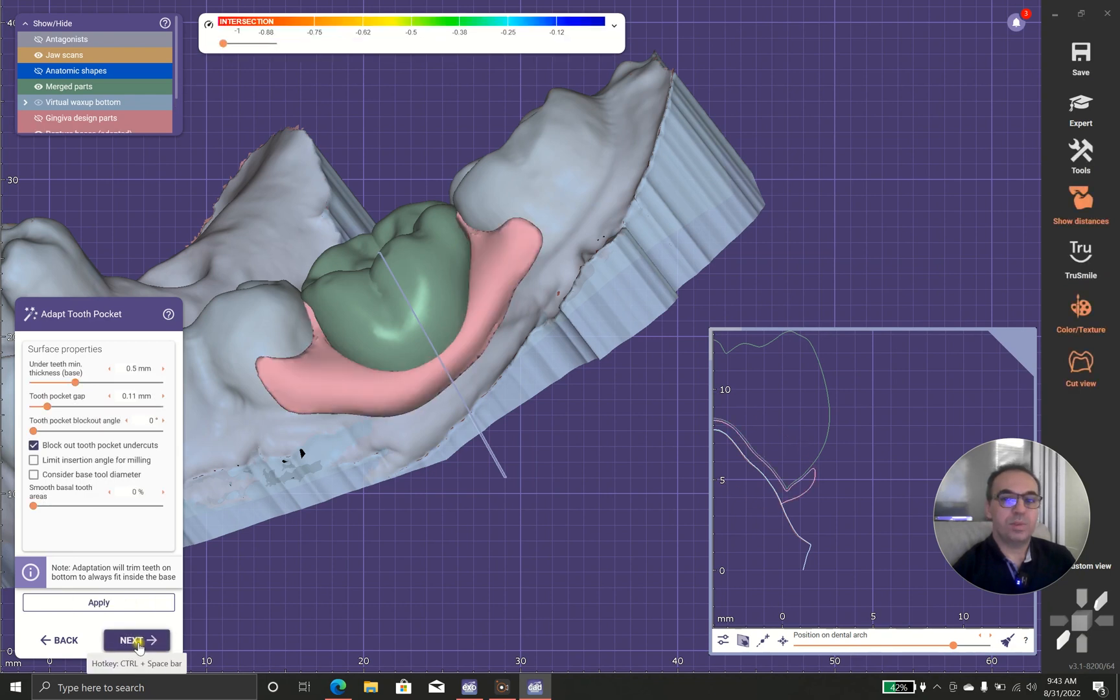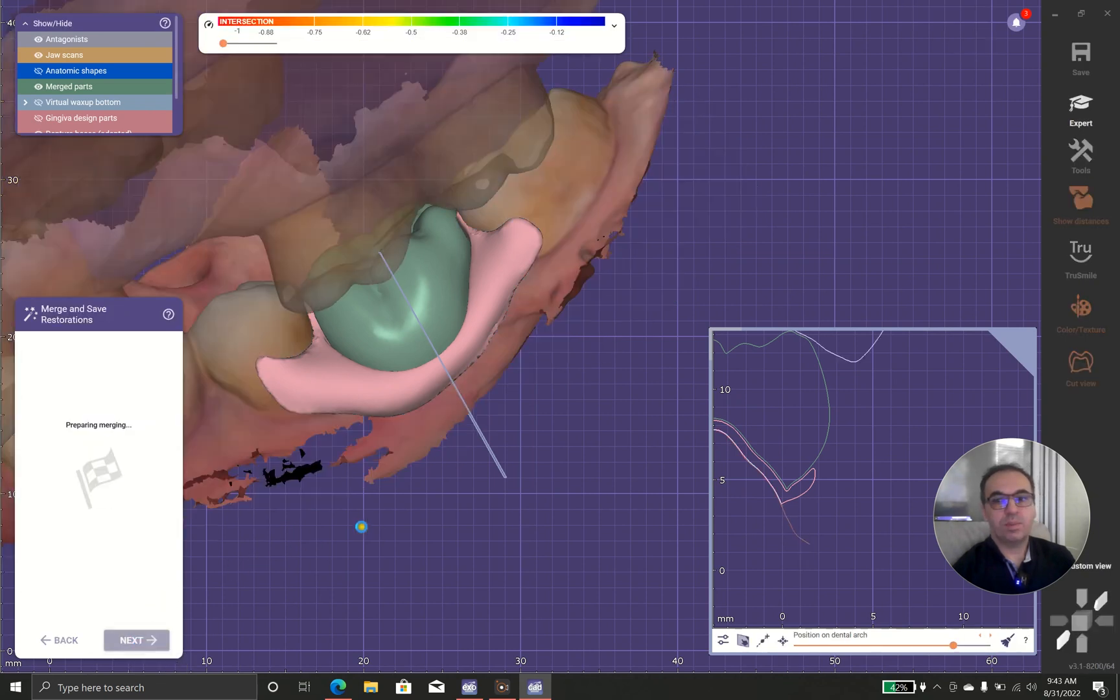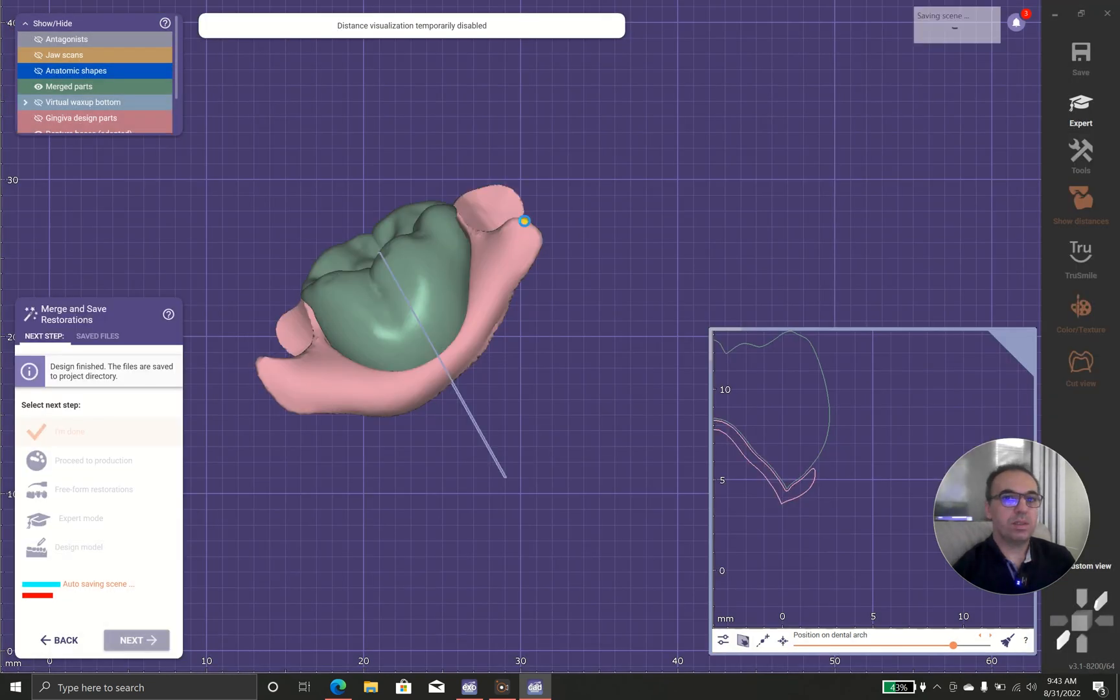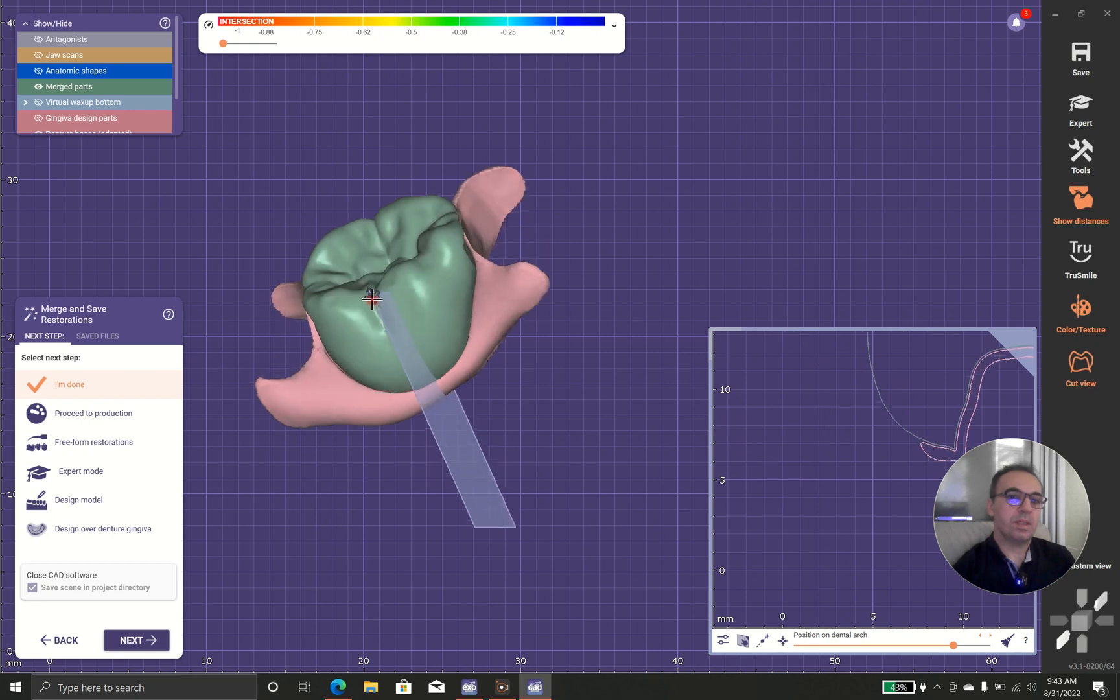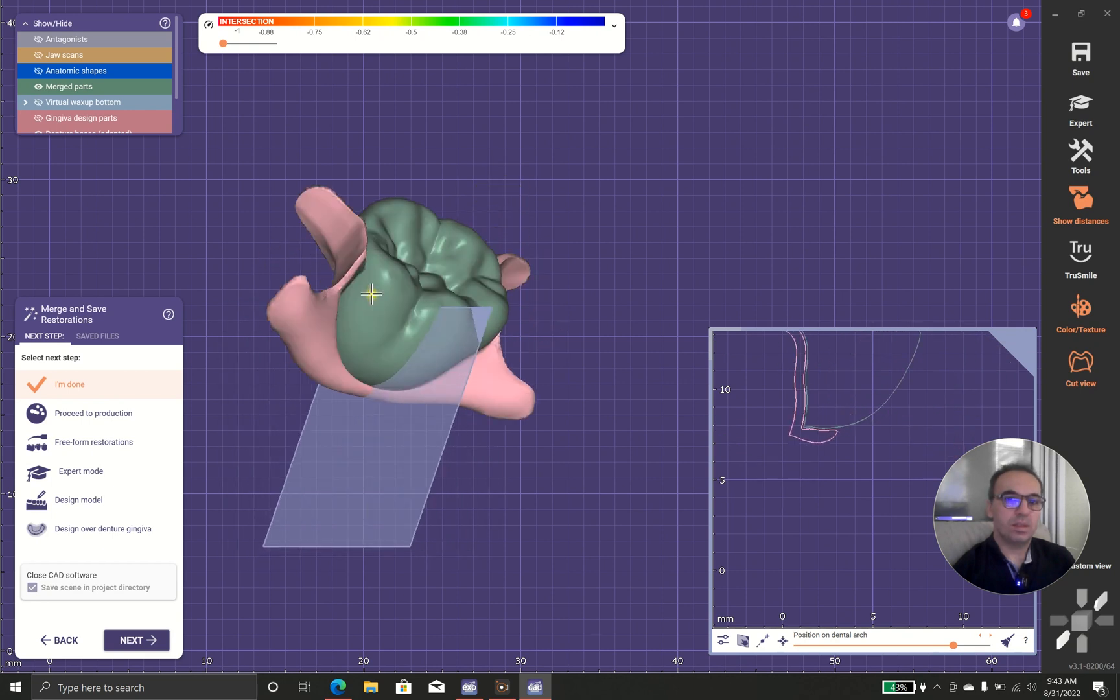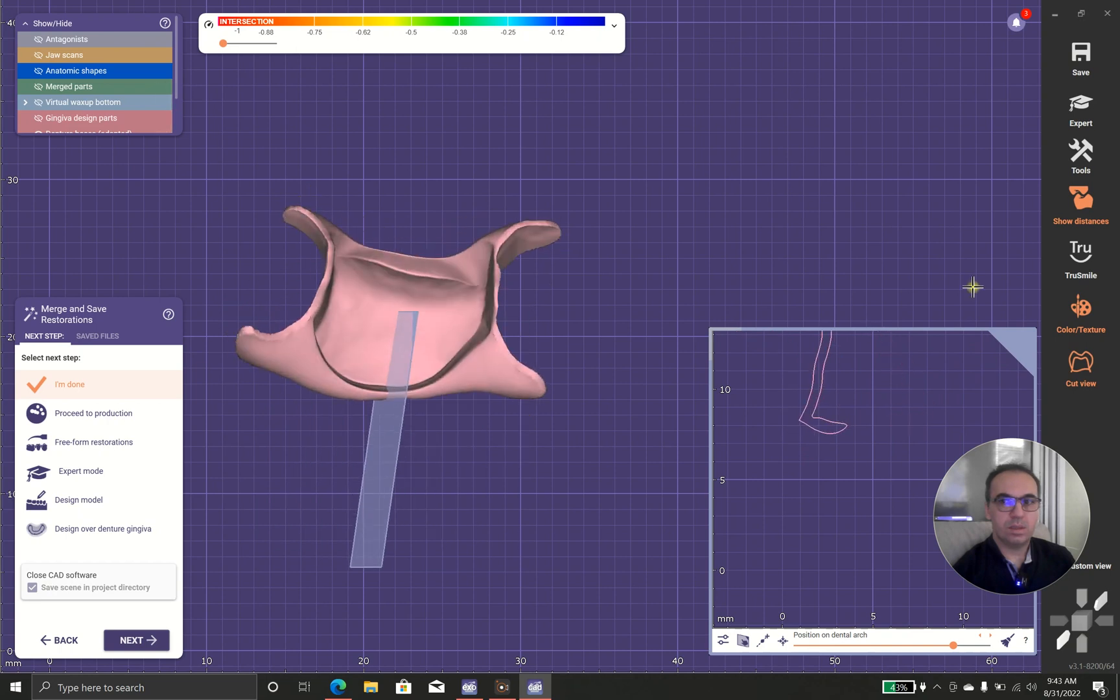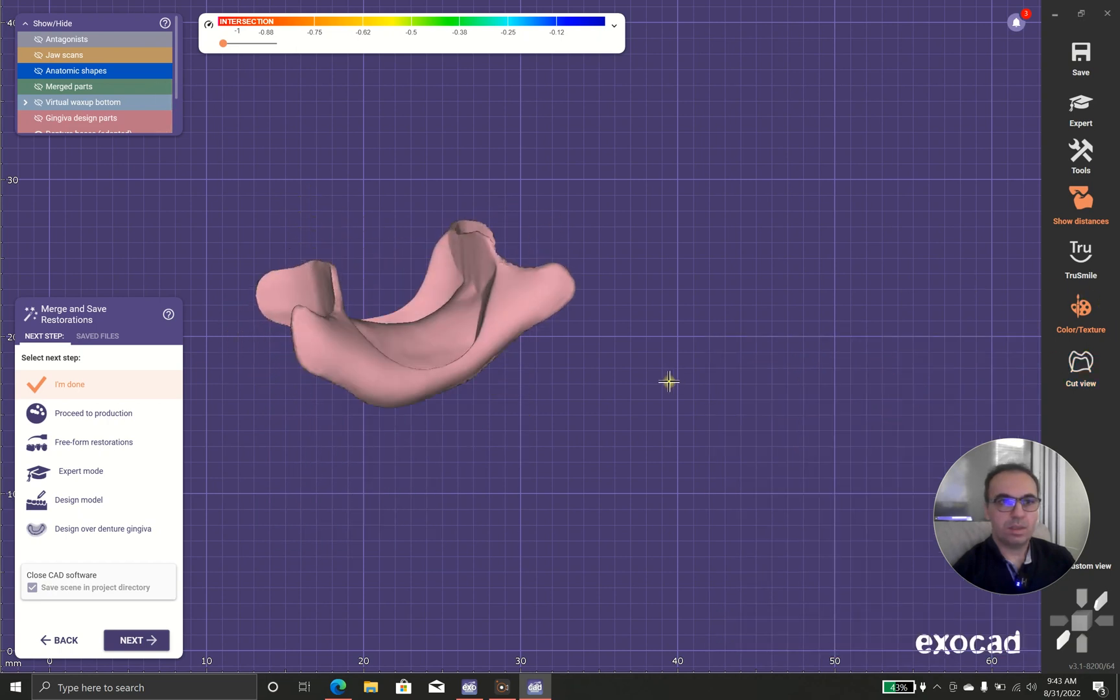But of course, it's a complicated process because you have two pieces. You should glue them together with the base denture resin. And as you can see, there is a gap and there are the teeth.